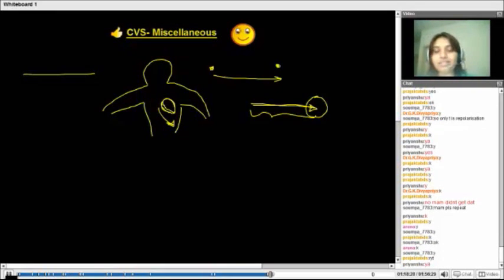But whenever we are considering a heart, we have to define the horizontal, and then we will define the direction of its impulse in relation to that horizontal. We have already defined the direction, so let's just define the horizontal here.